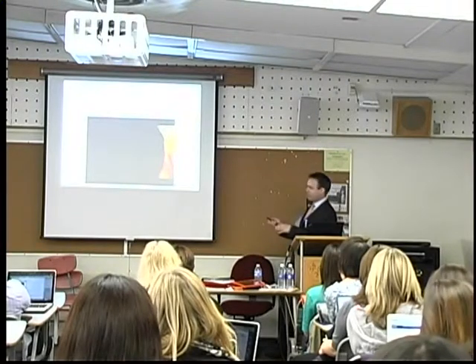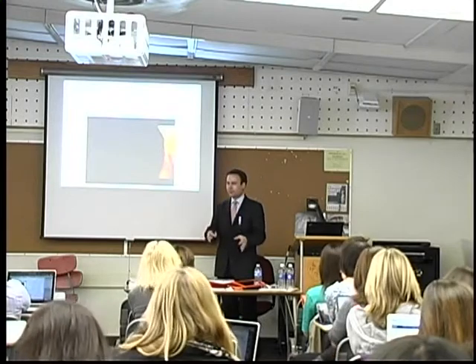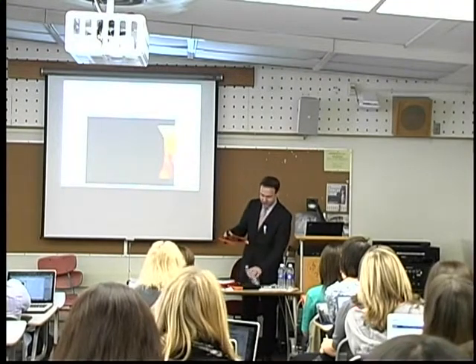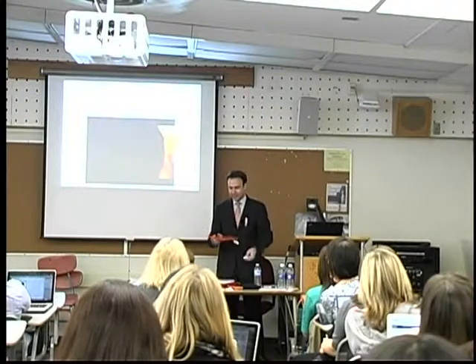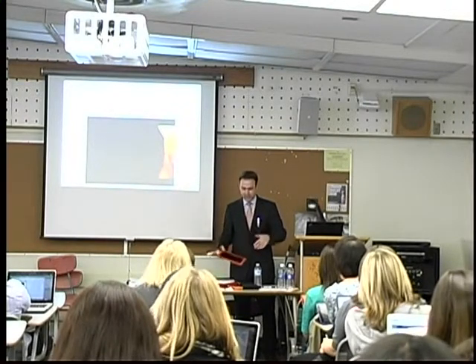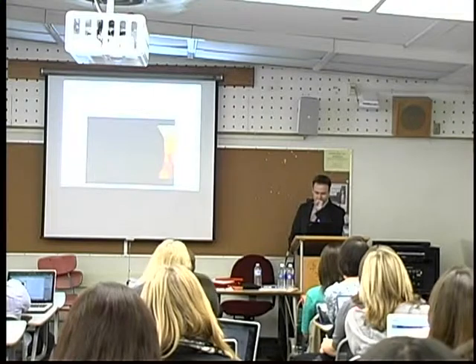We learned very early on that kids will push all types of buttons when you just put an iPad in front of them. So you could see in this prototype, we tried to cover up the home button just with duct tape and with paper towel and stuff like that. And nowadays you can do this easily within the accessibility functions. You can block that, and you have Guided Access and so forth.